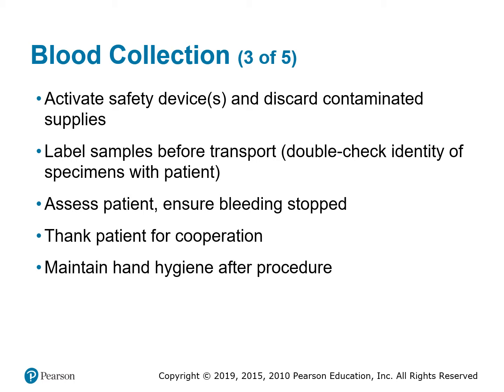Now, there are two ways of capping. The one in class, I teach y'all to depress with the thumb and up. Now, there is a safety collection cap where you have to gently cap it on a hard surface, not on the patient's bed by no means. You just don't do it on the patient's bed, only on a hard surface.